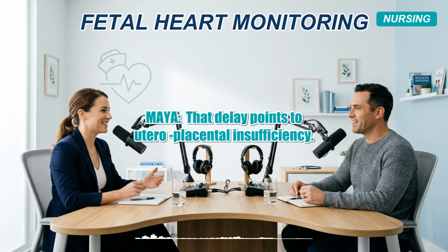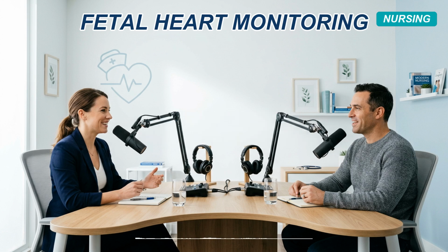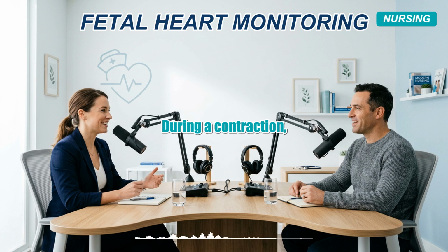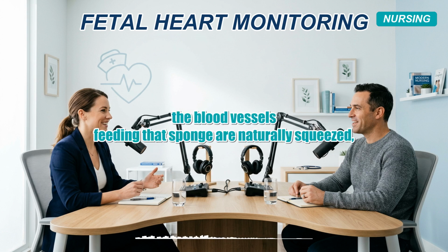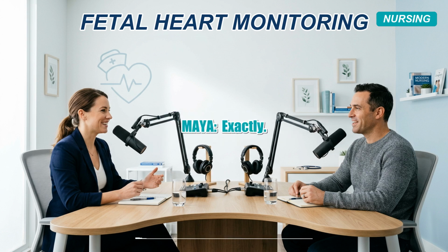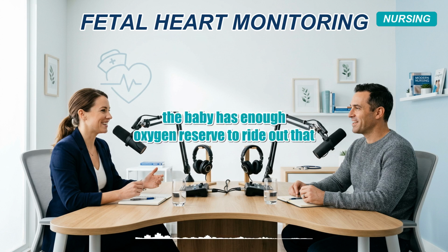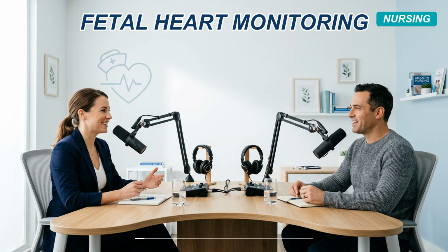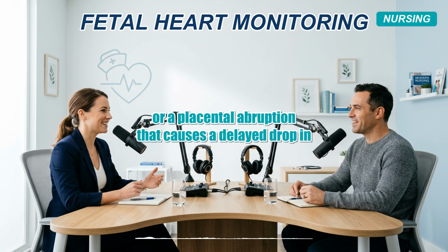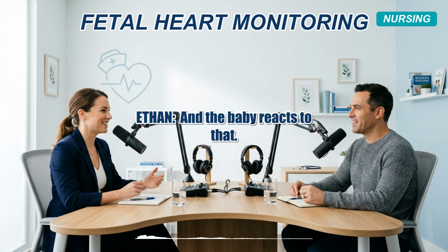That delay points to uteroplacental insufficiency. Think of the placenta like a sponge full of oxygenated blood. During a contraction, the blood vessels feeding that sponge are naturally squeezed, temporarily reducing blood flow. Like stepping on a garden hose for a minute. Exactly. If the placenta is healthy, the baby has enough oxygen reserve to ride out that squeeze without a problem. Makes sense. But if the placental reserve is already compromised, maybe due to maternal conditions like preeclampsia, low blood pressure, or a placental abruption, that causes a delayed drop in the baby's actual oxygen levels. And the baby reacts to that.